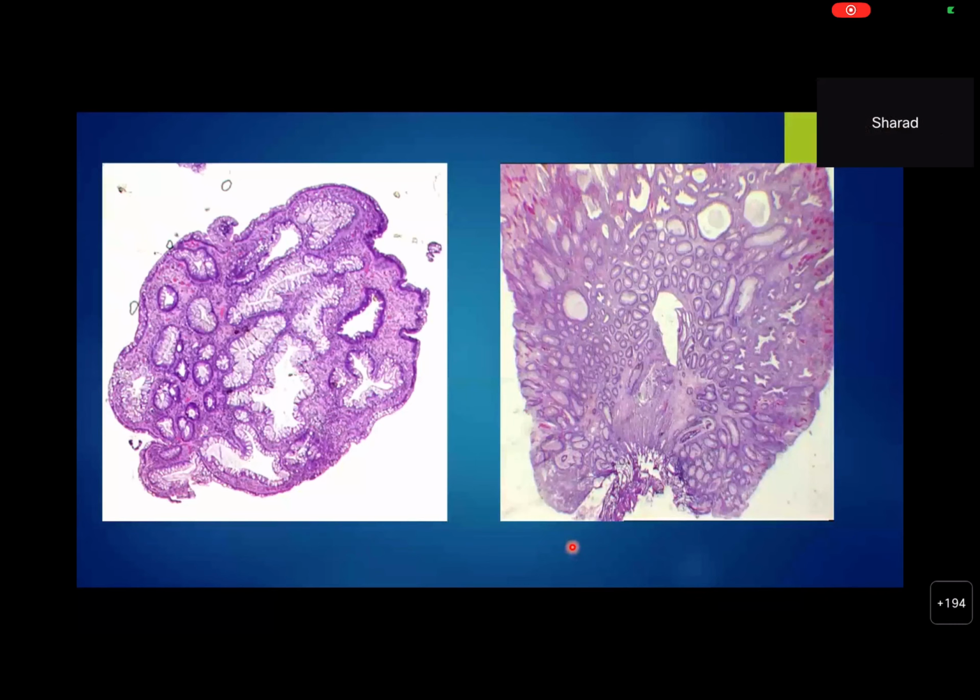Right side, I have seen 2 figures. Biopsy from the polypoidal structure, which is lined by columnar epithelium, and I have seen a few dilated glands in the mucosa, lamina propria, sorry. In low power view, a few of them are normal and a few are dilated, and I think mucin rich. Yeah, white color, not blue. And this architecture, infoldings, and branching type. What is this architecture called? Serrations. So this polyp is showing us serrations.